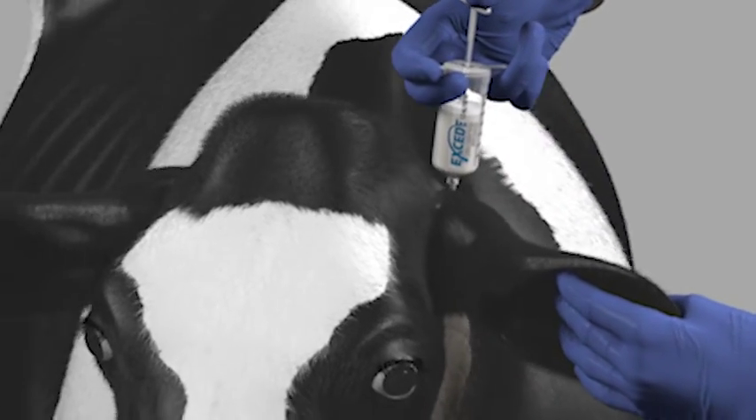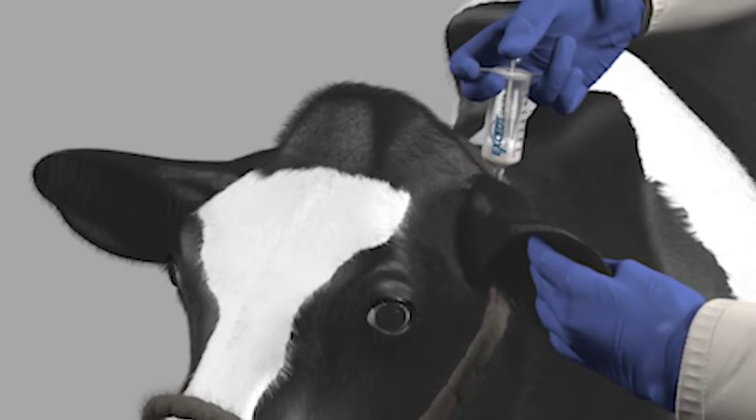Inject the full dose of EXCEDE, maintaining needle position until the injection is complete.